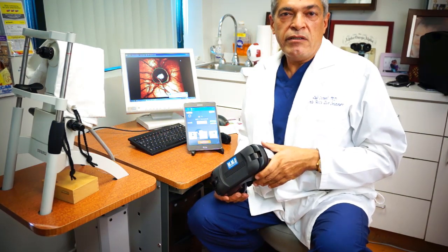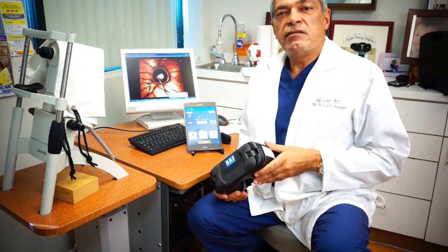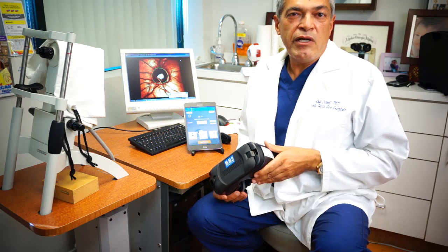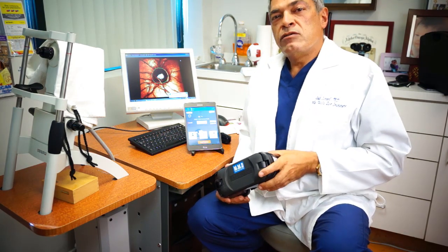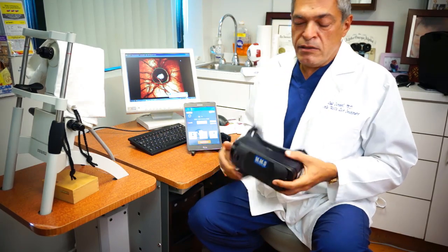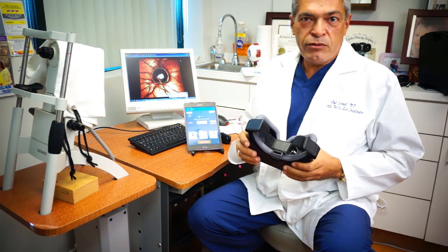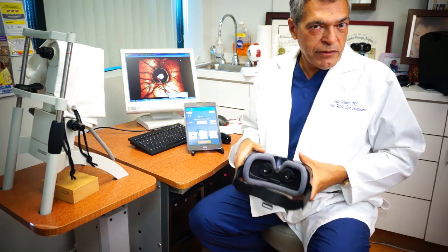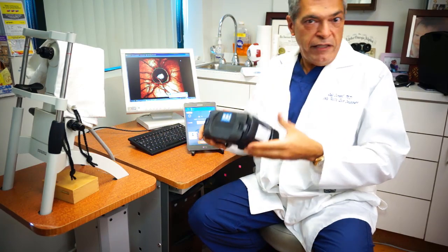Most commonly, these patients are pediatric patients and patients that are handicapped and are unable to come to the machine itself. For pediatric patients, it's a great device. Most of the kids already know how to use virtual reality goggles, and if they don't, they get used to it very fast.